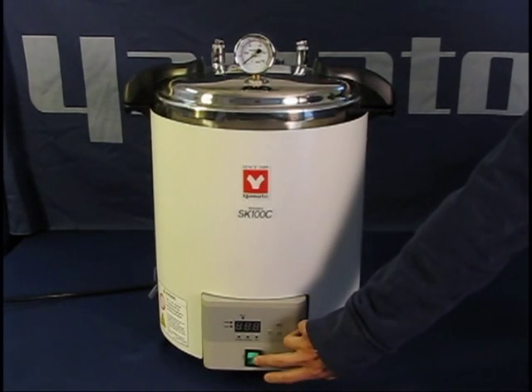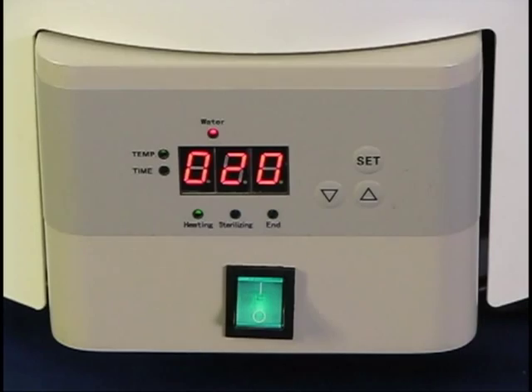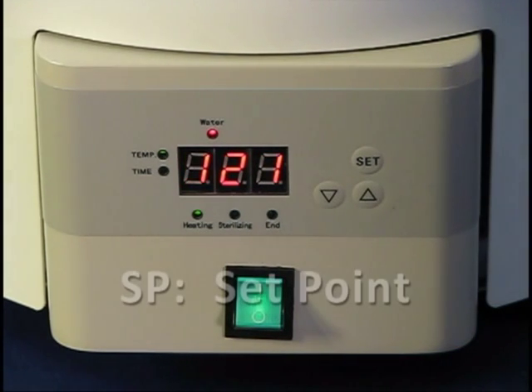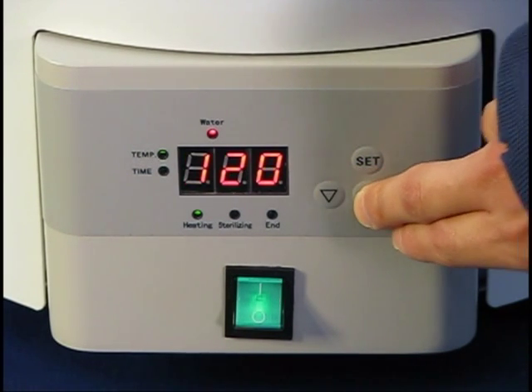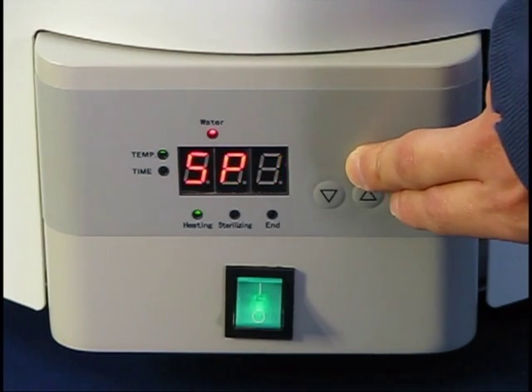When the unit is first turned on, it will display the temperature inside the chamber in degrees Celsius. Press the SET key to your target temperature. SP will flash to indicate that you can use the arrow keys to enter your set point temperature. Press the SET key again to set your sterilization time.